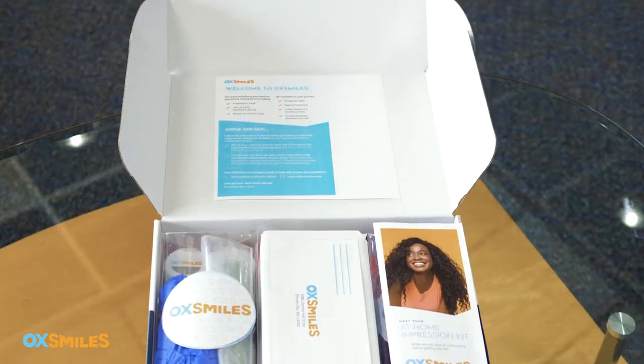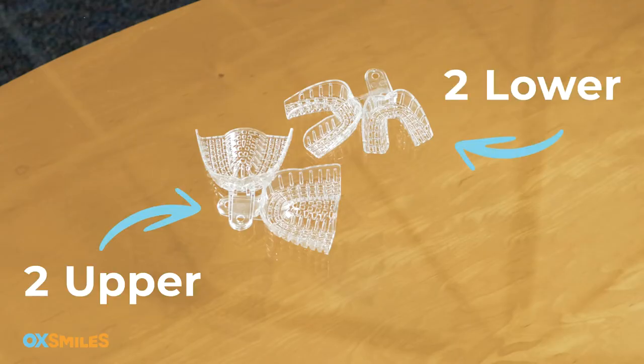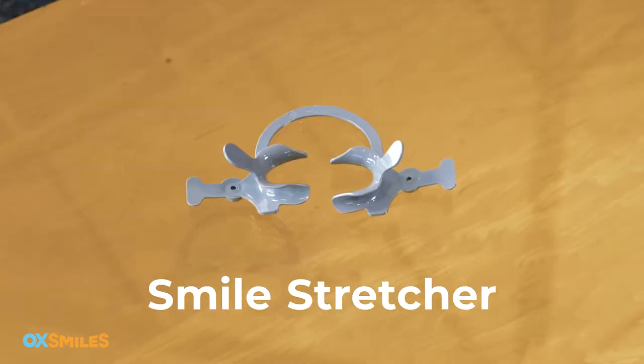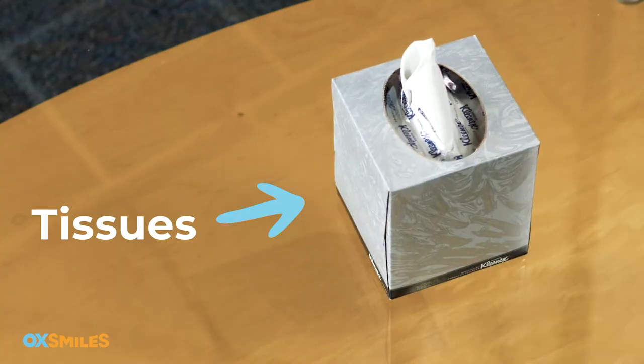Open your OX Smiles box and remove these items from your impression kit: gloves, two sets of impression trays (two upper, two lower), eight putty jars labeled A and B, and your smile stretcher. You will also need a timer — your phone works great for this — a mirror, and a few tissues to have on standby in case you drool. It happens.